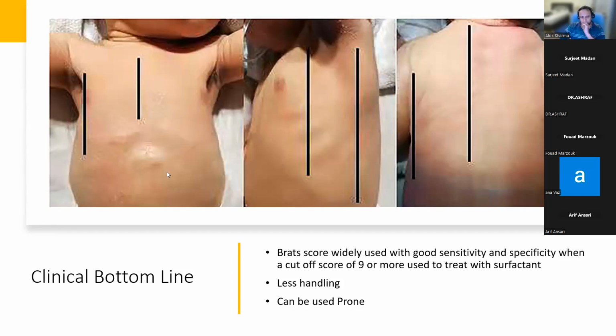So I have a question about it. Please. Yeah, the question is, in this given scenario, if our clinical examination is unremarkable, should we still go for an ultrasound early, or should we wait until the next dose is due? Usually we wait 12 hours, don't we, before the second dose?